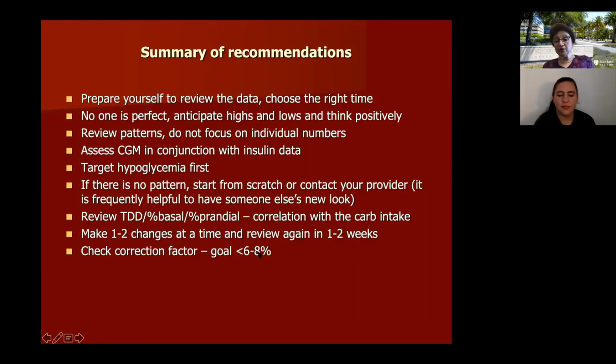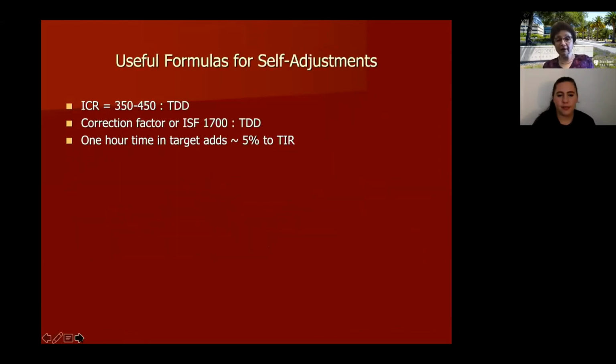Look at your correction factor. If your correction factor is more than 6 to 8%, that means something was not right to begin with, and you keep correcting it. So try to estimate, what can I change so I won't have to correct that much?